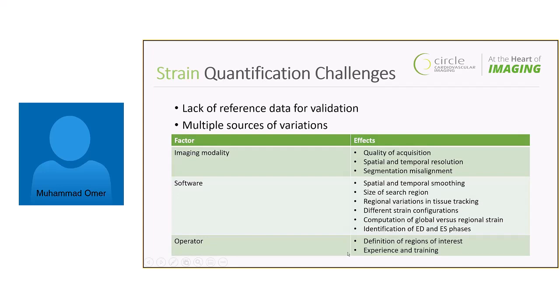The last factor is operator-related, where the operator's experience or training may come into play in the detection of the regions of interest, which are again very important when we are designing algorithms for feature tracking.